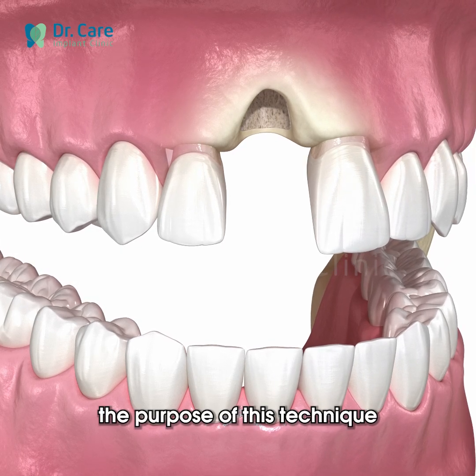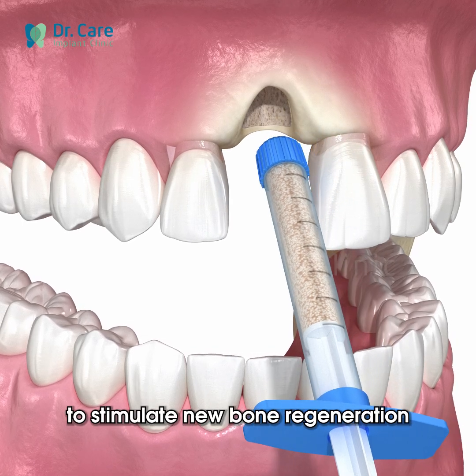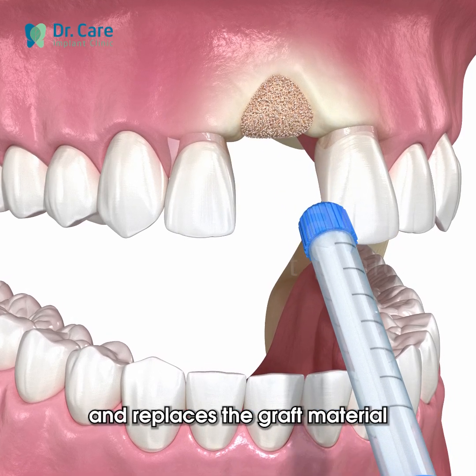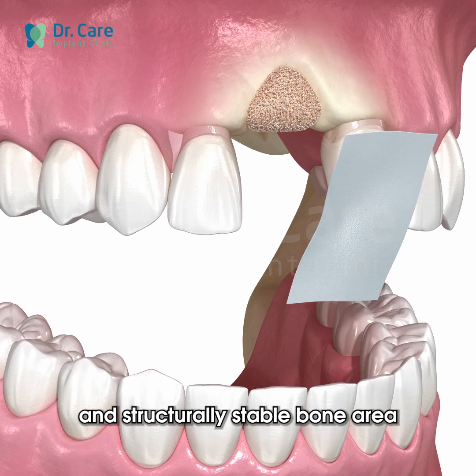The purpose of this technique is to replace resorbed bone in the jaw by using bone graft materials to stimulate new bone regeneration. As the natural bone grows, it gradually integrates and replaces the graft material, forming a fully restored and structurally stable bone area.